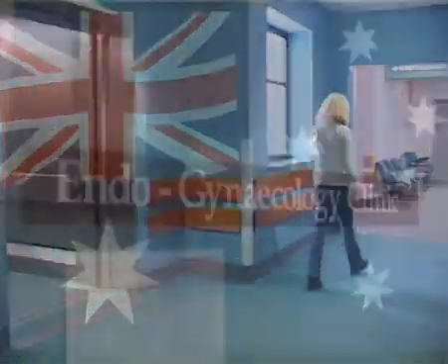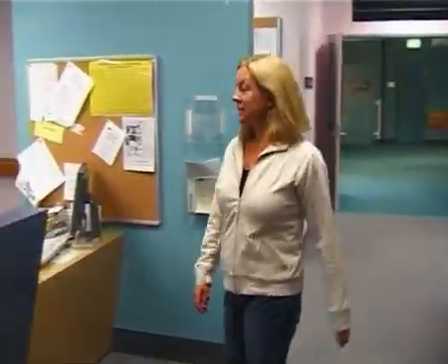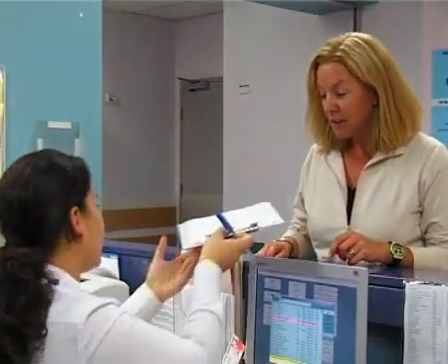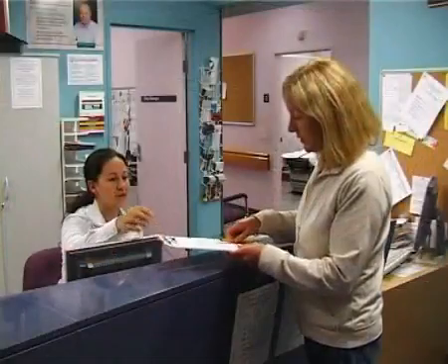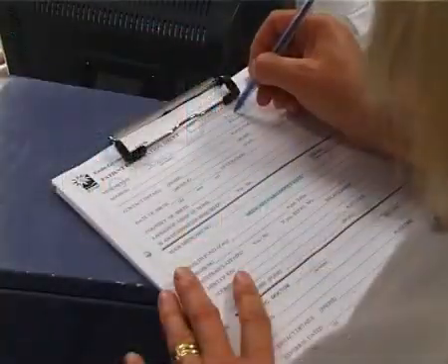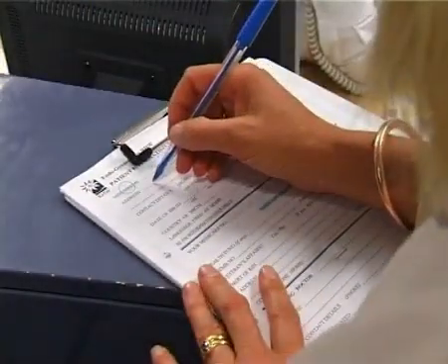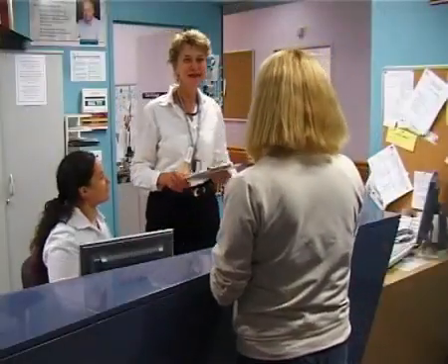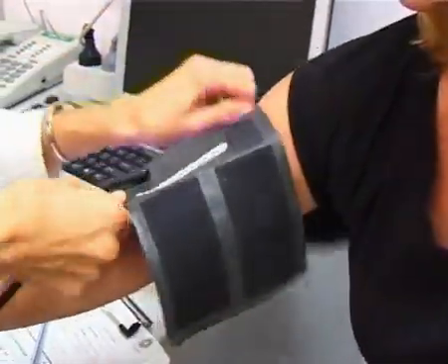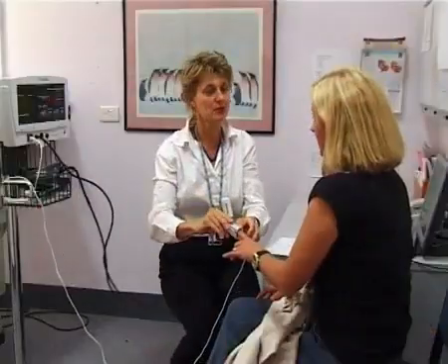Hysteroscopy, with dilatation of the cervix and endometrial curettage under general anaesthesia, has long been considered the method of choice for the investigation of abnormal bleeding and other diseases affecting the uterine cavity. With the introduction of smaller diameter scopes in the early 1990s, outpatient hysteroscopy became a more realistic option for both doctor and patient, with potential benefits including less anaesthetic risks, decreased costs, and increased patient choice.